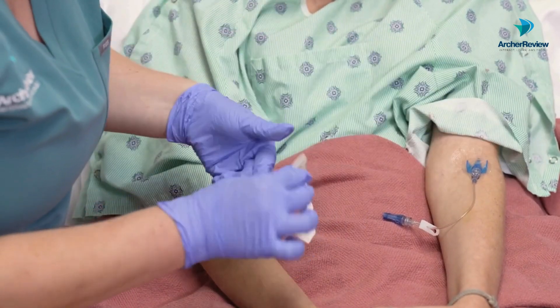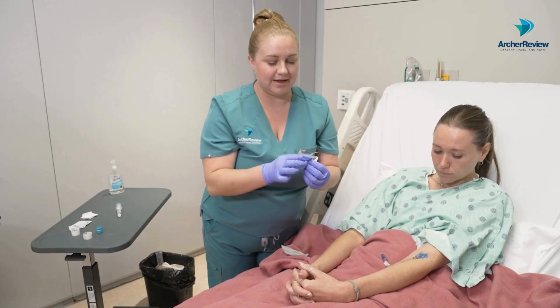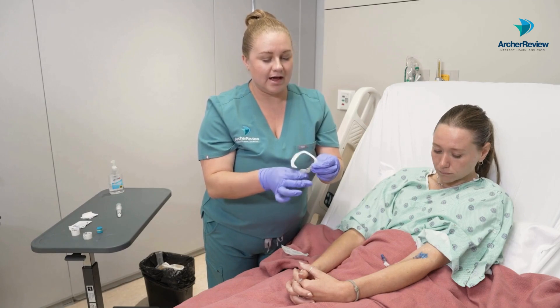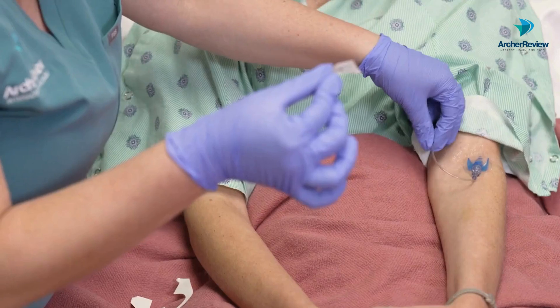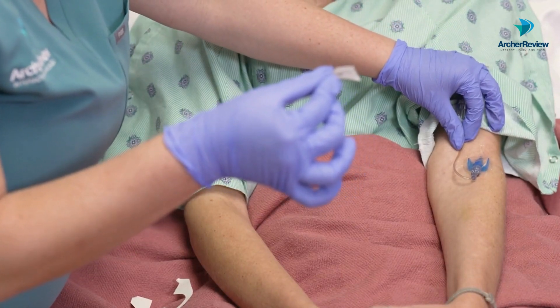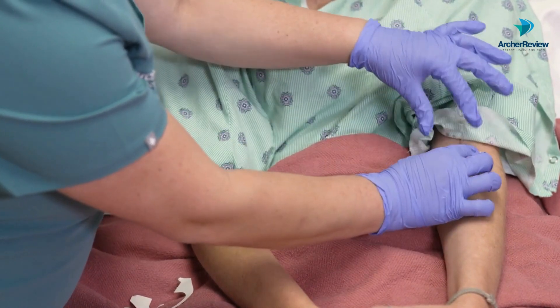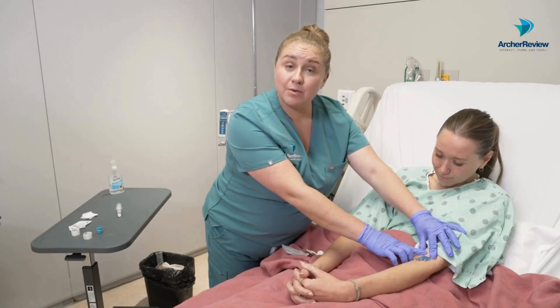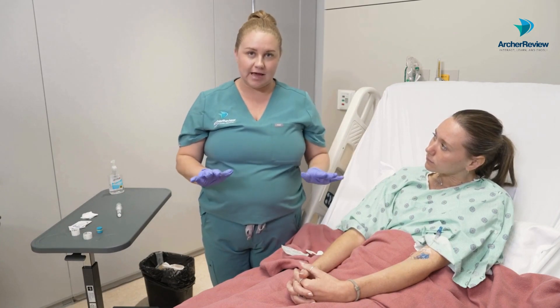Peel off those margins — that looks so much better. Last but not least, we know we don't want this extension tubing laying down there, so let's go ahead and pull off that extra piece of tape that should come on all your IV dressings. Pull the extension tubing up into a J and place that right there. We'll then go ahead and label and date the time that this dressing was changed so we know when it needs to be changed again.